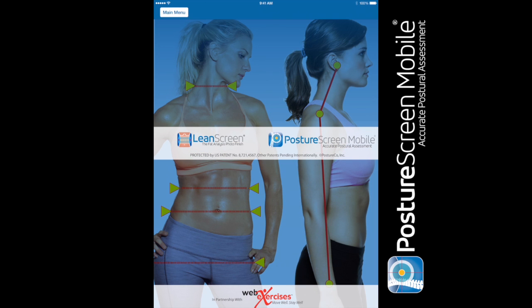Welcome back to the posture screen tutorial series. In this tutorial we're going to show you how to use the motion capture analysis tool to add an axial rotation posture assessment.